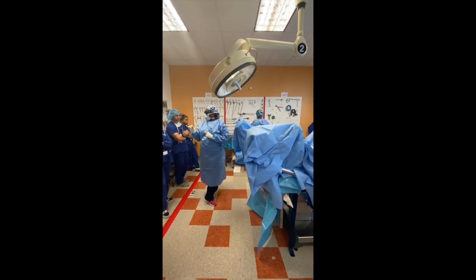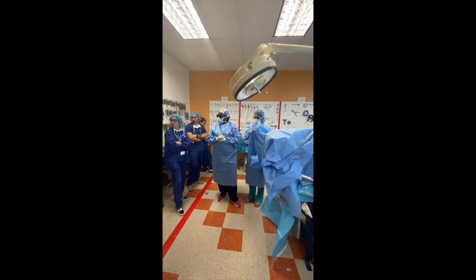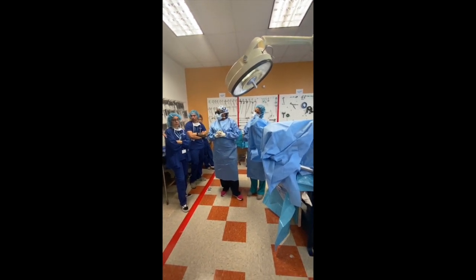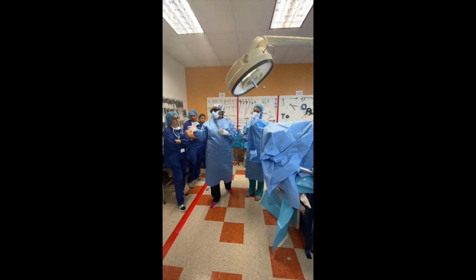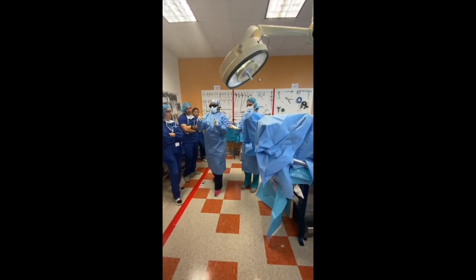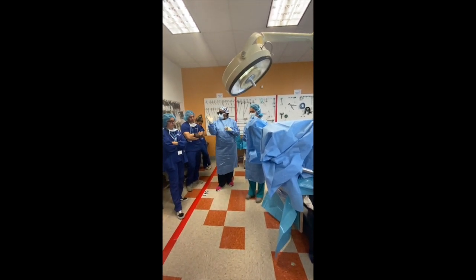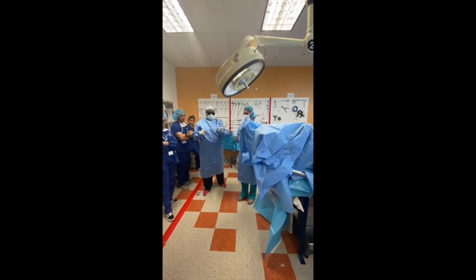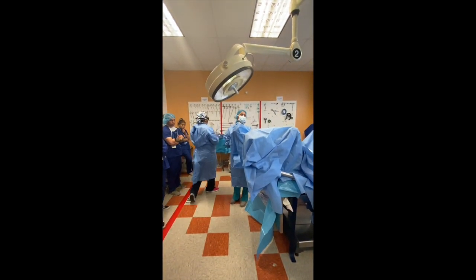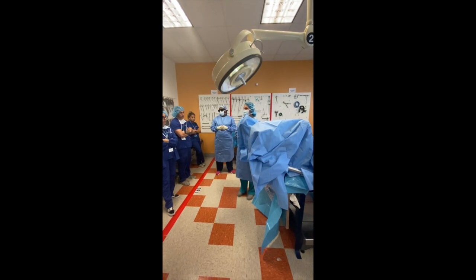So when putting on the butt drape — if we contaminate, we're just a single one? We like to do the leg drapes first, but you flow with your surgeon. Normally we don't ever have to worry about the butt drape, so we're accustomed to leggings first. Sometimes surgeons say don't call me in the room until you're draped — then it's all you. Do your leggings first, especially if you're by yourself.